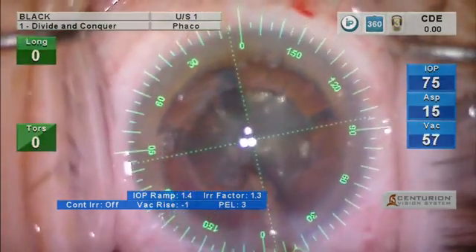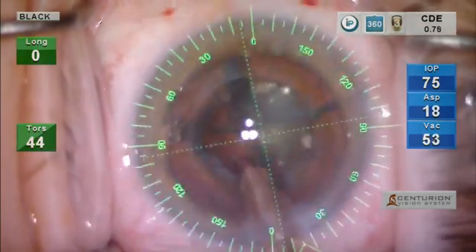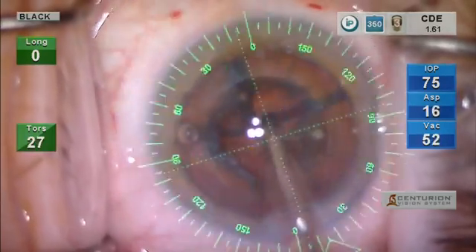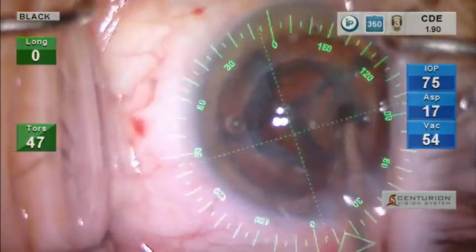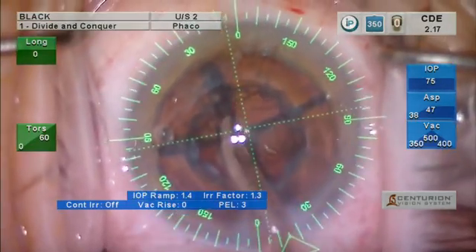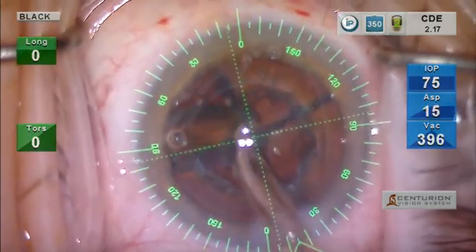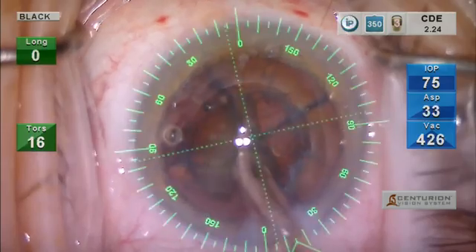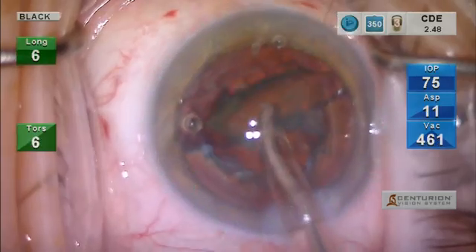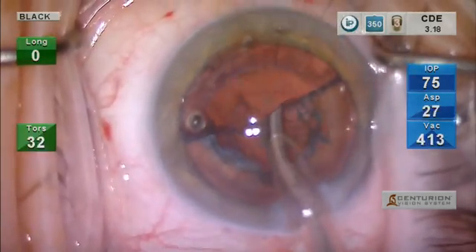The Luxor microscope gives us ideal illumination and visualization, which I think is very important in femtosecond laser cataract surgery. There is a lot of hydration of the nucleus with the fragmentation pattern. This is a grid pattern, as you can see, and the nucleus came out very easily in a moderately dense cataract. We then will remove the fragments of the quadrants here, as you can see.